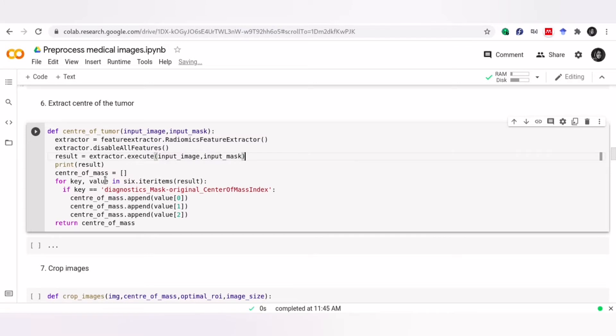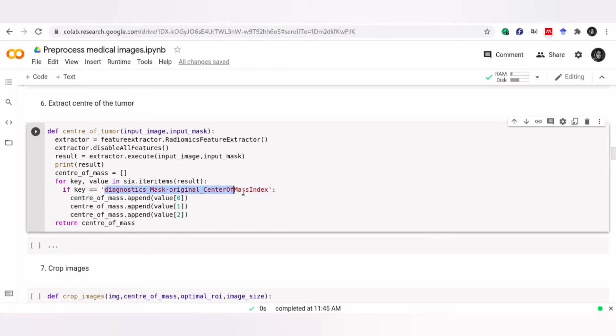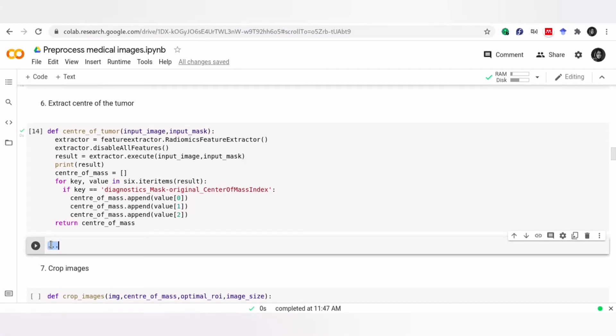Also, we have disabled all features, this result contains many features. So, here we need to extract what we want. Now, let's check the results.